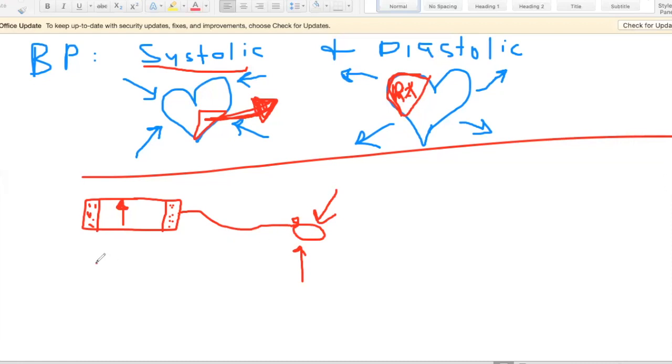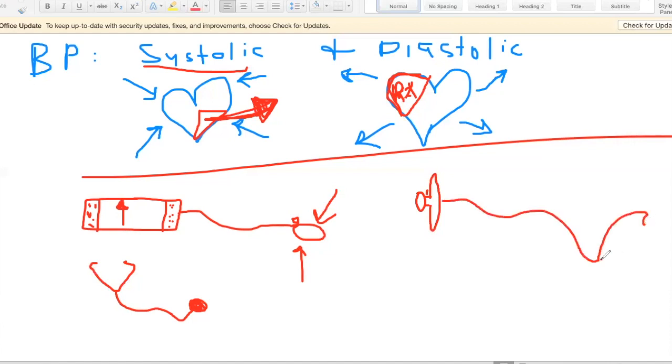You're also going to have a stethoscope, which is your earpiece and another earpiece. And you're going to have this long tube. Sure, everybody's seen these things. It's attached to your earpiece, which is attached to a drum or your bell. So if you look at that piece right here, oftentimes it'll look like this. It has one side to it, and then it has this part here, and then it has another side to it, which is flat. It has another tube right here that you can switch. And then over here, it has the long tube, and then you have your earpieces like this. And you take these things and you put them in your ears.